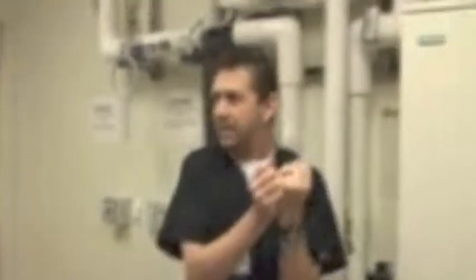So that's the copper wall right there? That's part of that? And if we had anything into the room, like if we want a line in there for a monitor or whatever, they have to use what's called a filter. I don't think they're all covered by the box, but basically it's called a filter where the cord has to go through, and it's basically sealed as tight as possible.